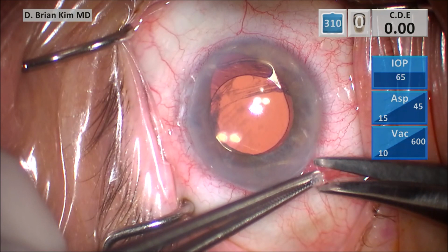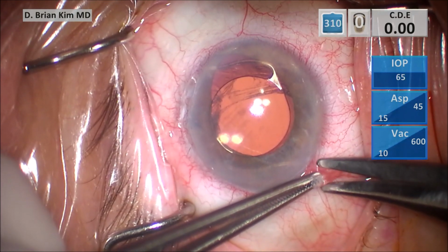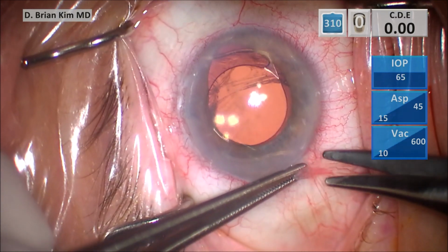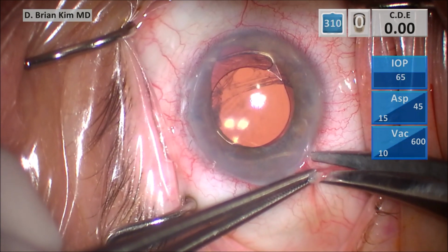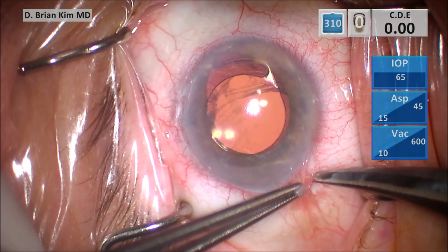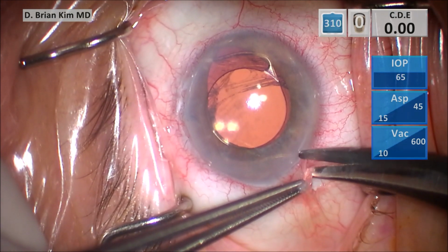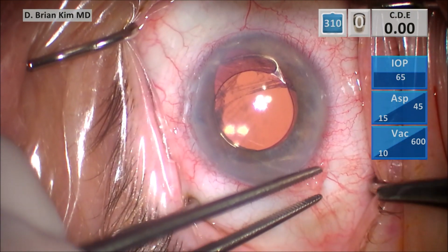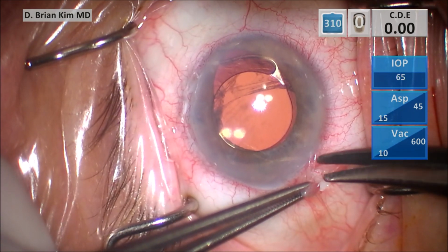Again, over 6 diopters of astigmatism, visual distortion from the dilated pupil, some corneal edema, persistent CME. And so my plan of attack is to make a scleral incision that is going to hopefully offset the large amount of against-the-rule astigmatism by making a temporal, large scleral incision, taking the ACIOL out, closing that incision, and then executing the Yamane technique as well as the pupilloplasty.